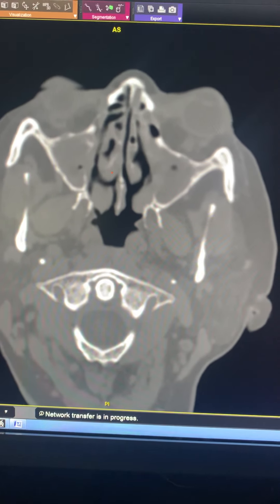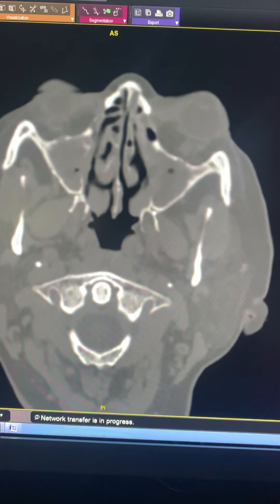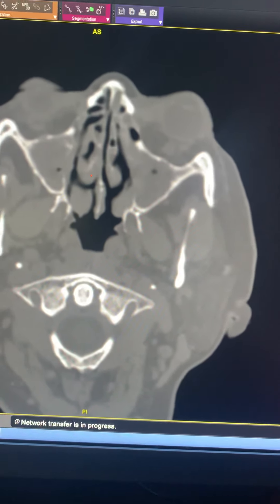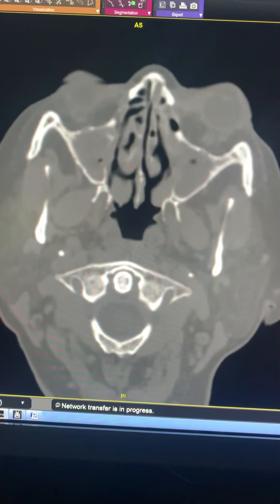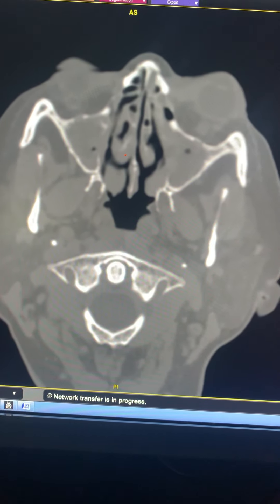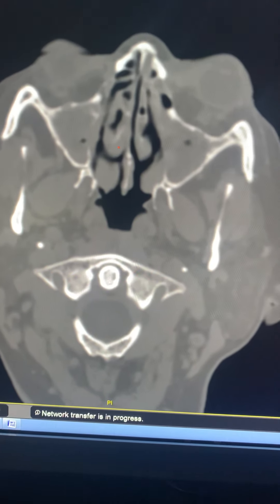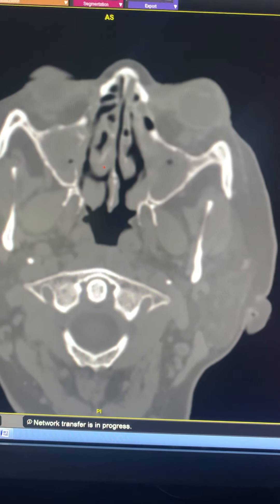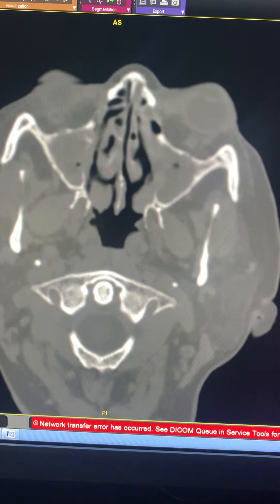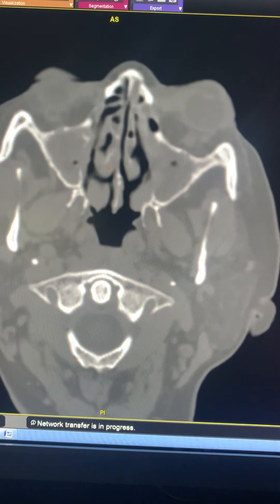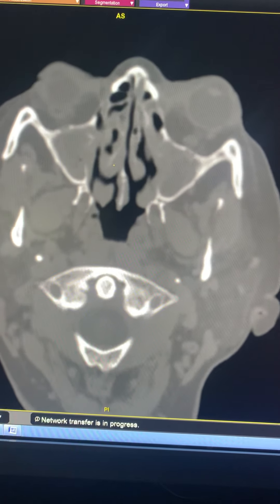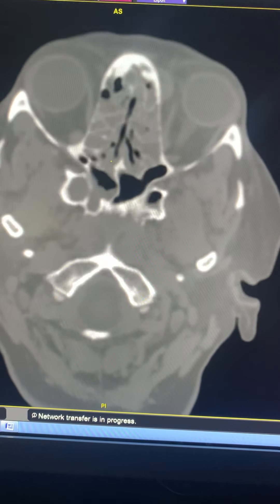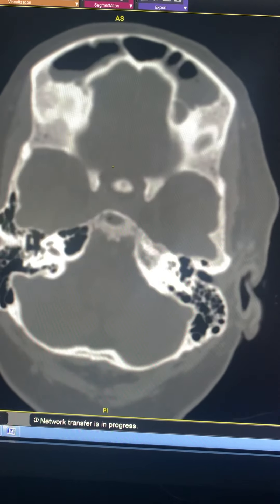This is a case of a 45-year-old female post-COVID patient with type 2 diabetes mellitus, suspected of fungal sinusitis. We see mucosal thickening with heterodense contents in bilateral maxillary sinuses, ethmoid sinuses, sphenoid sinus, and also in the frontal sinus.